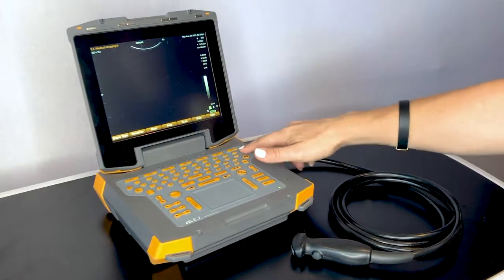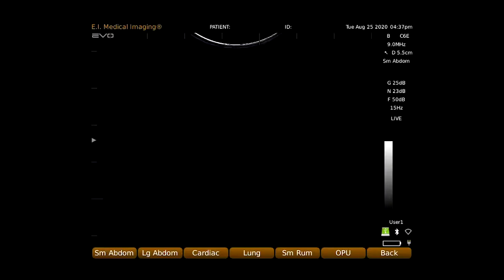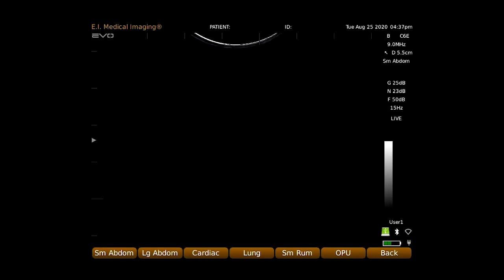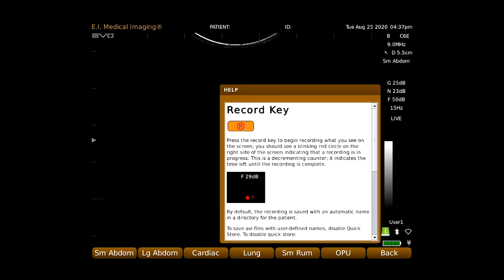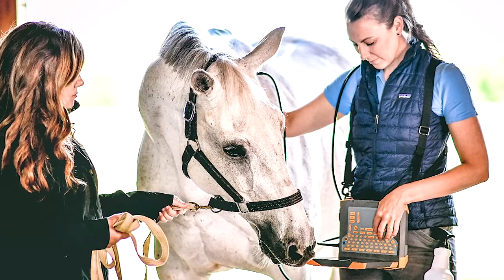Forget how to use a feature but don't have time to look at the owner's manual? Use our handy help button for context-sensitive assistance with any button with a designated function. The Evo has an intuitive user interface that allows for simple adjustments.